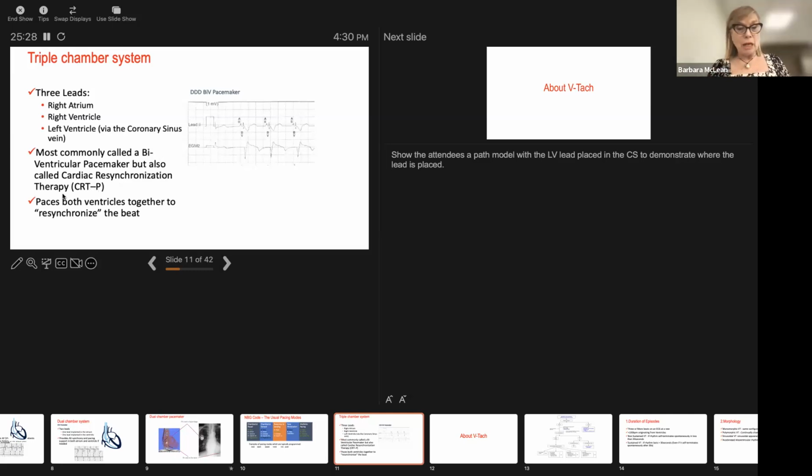Now, if you're interested in heart failure, you listen to talks about heart failure, you will often hear people talk about CRT. CRT is cardiac resynchronization. So just imagine with me. So this is my right hand. So it's to your left, but it's my right hand. My pacing wire is in the right ventricle. So the right ventricle is stimulated and it contracts. And the impulse is spread through the wall to the left ventricle, which contracts later.